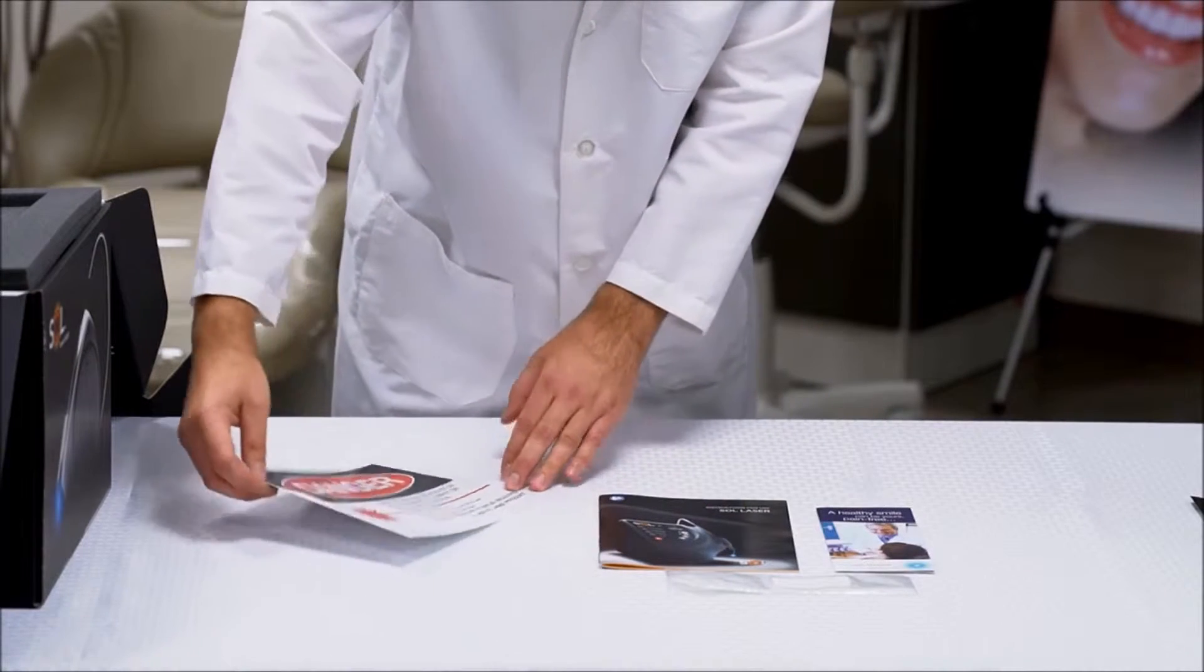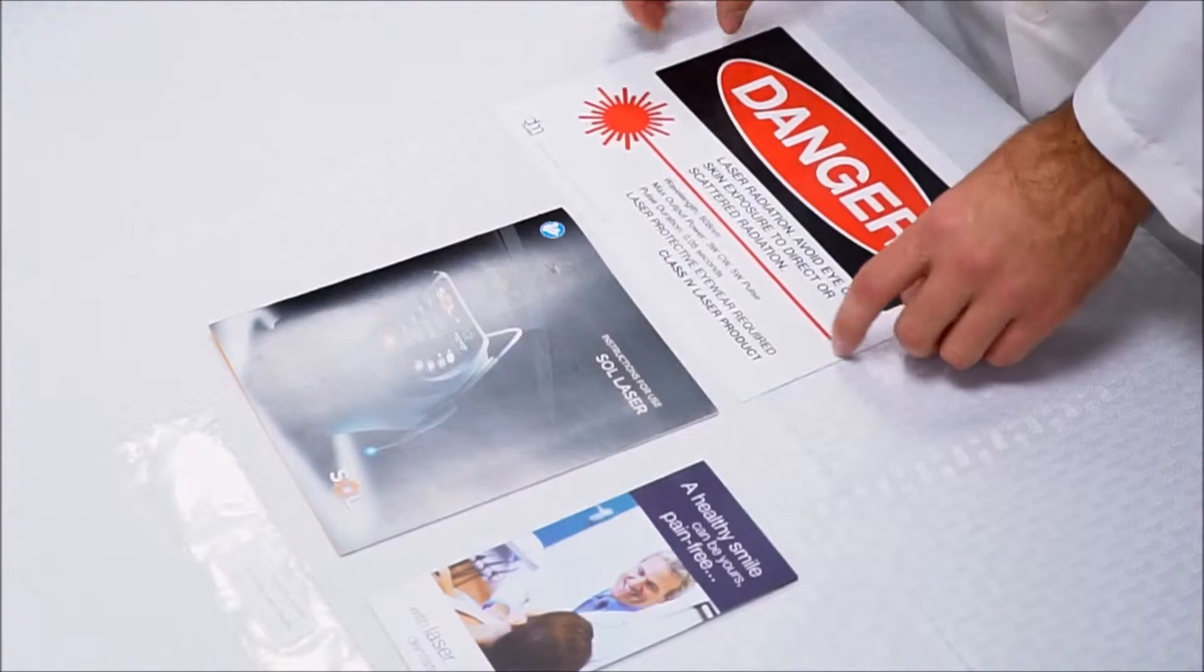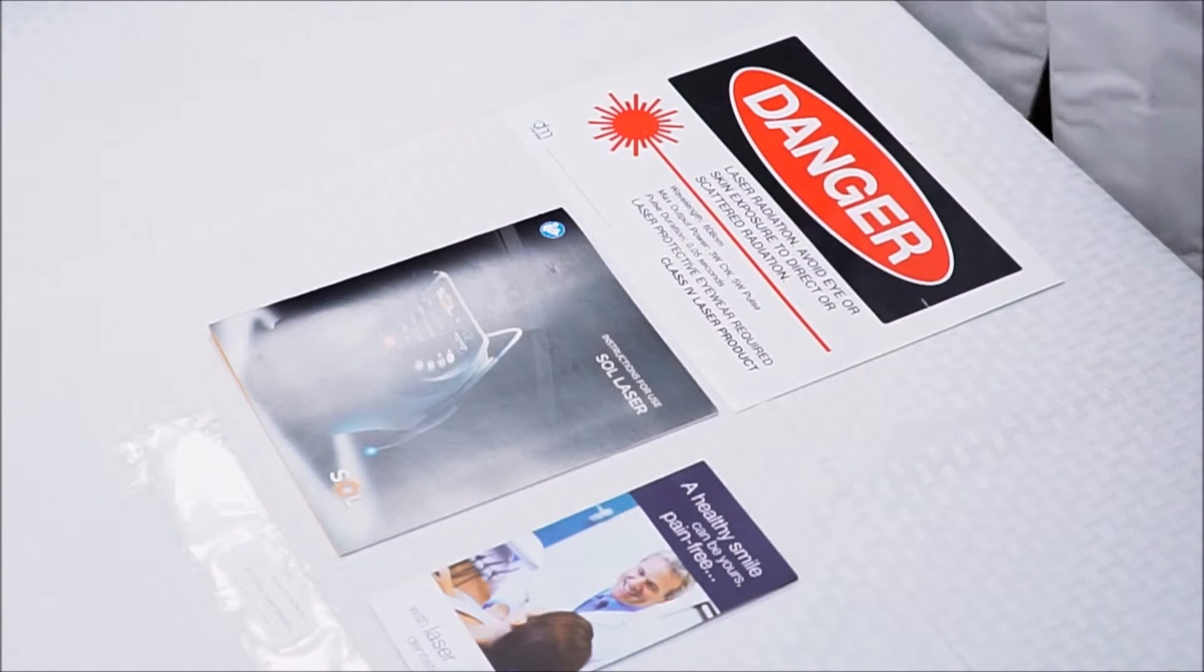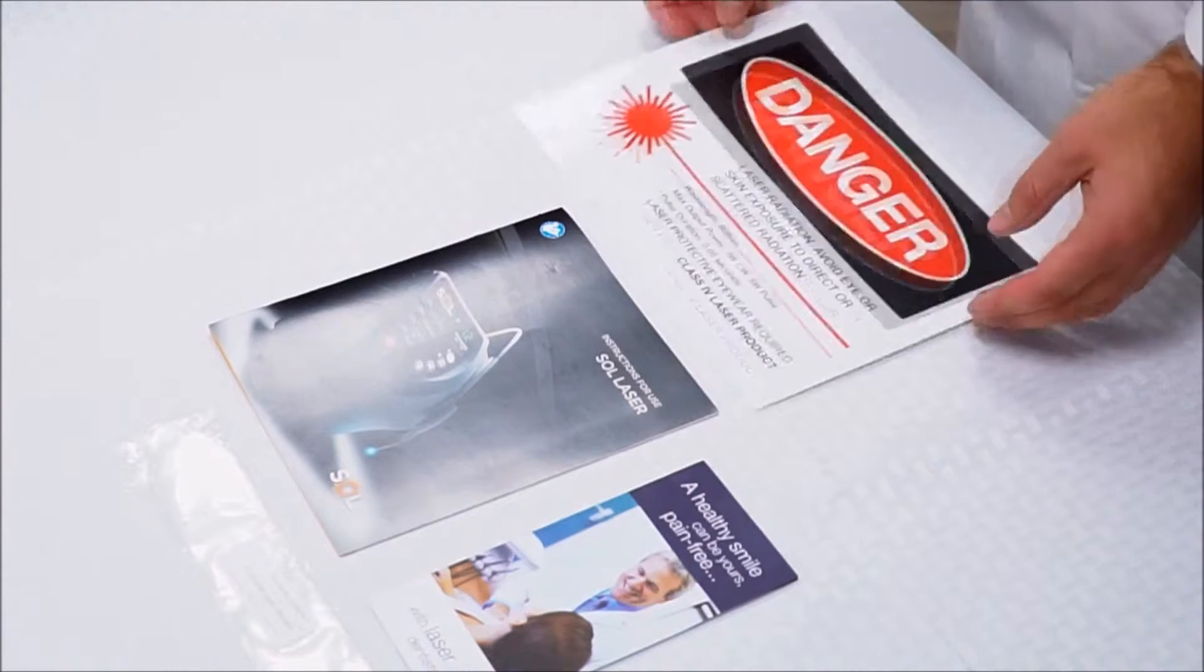Lastly, and probably the most important piece in here, is the danger warning sign. This should be put up outside of any operatory that you're practicing laser dentistry in. It will help warn patients or perhaps other members of your staff that laser procedures are taking place in the office.